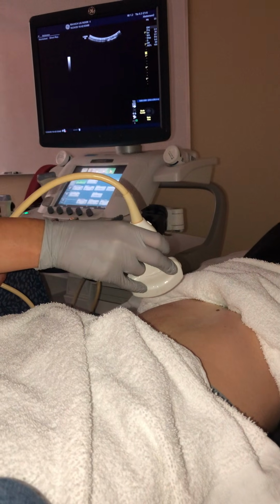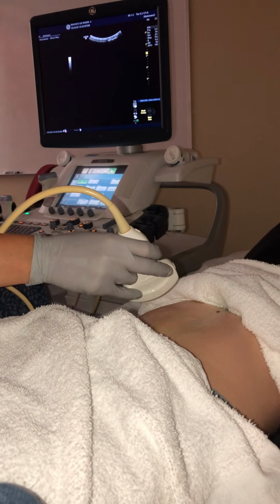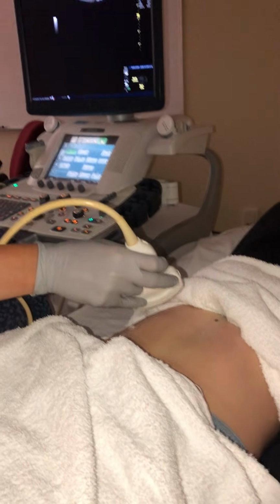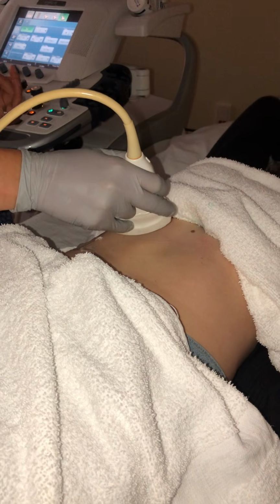We're gonna do our gallbladder. We know that sits in a different location for every patient, but we're typically gonna look in that right upper quadrant area. We know it sits in our main lobar fissure, so we're gonna see that surrounding liver tissue.